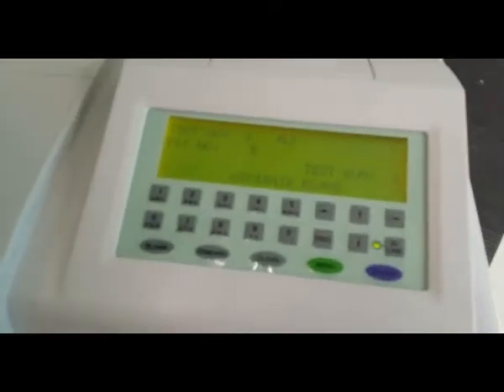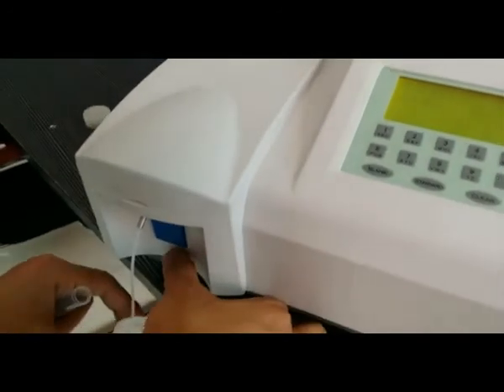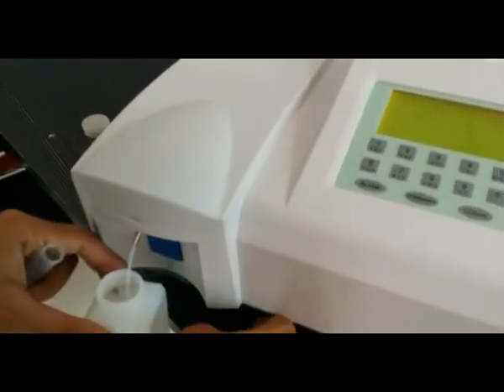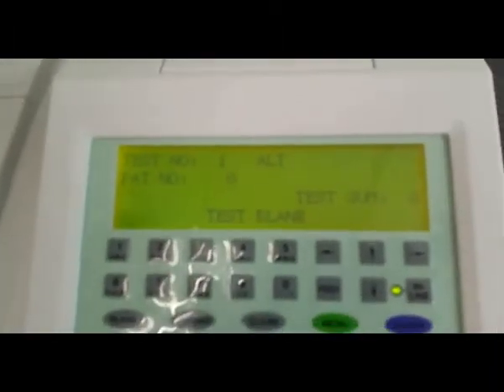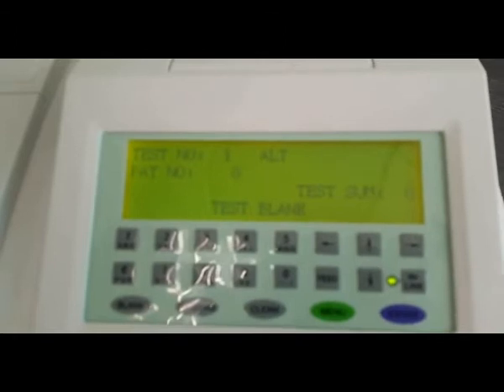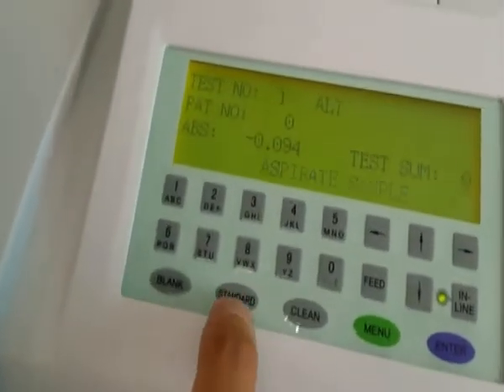Then test. No, no, no. Then test the blank. After test the blank, then test the standard.